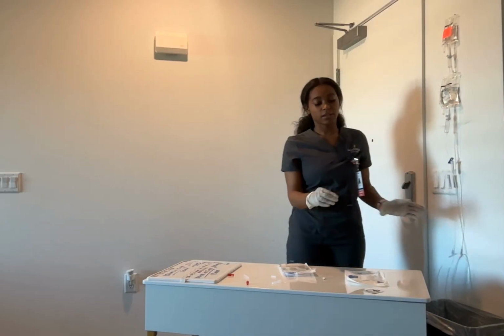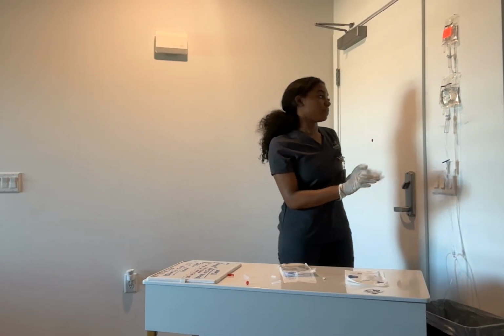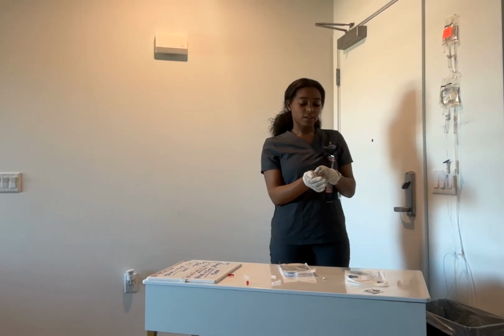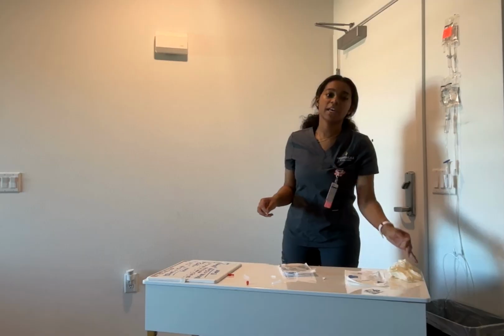Then we're going to check the IV site and make sure that it's not red. We're going to ask the patient if they have any questions or need anything. We're going to let them sit and we're going to remove our gloves, clean our mess, and provide hand hygiene, and that is it.